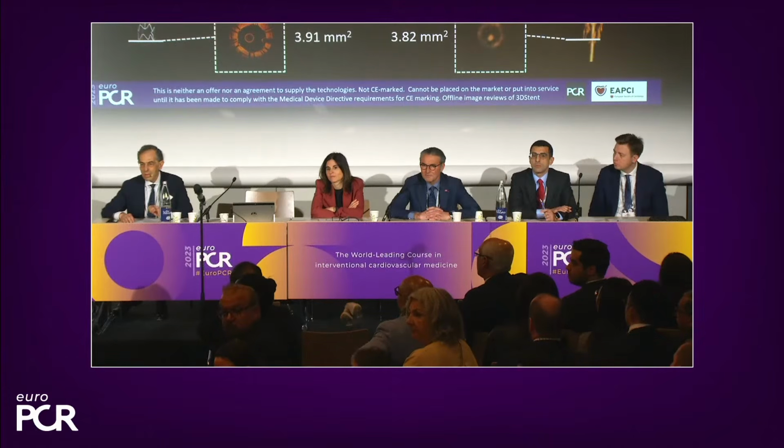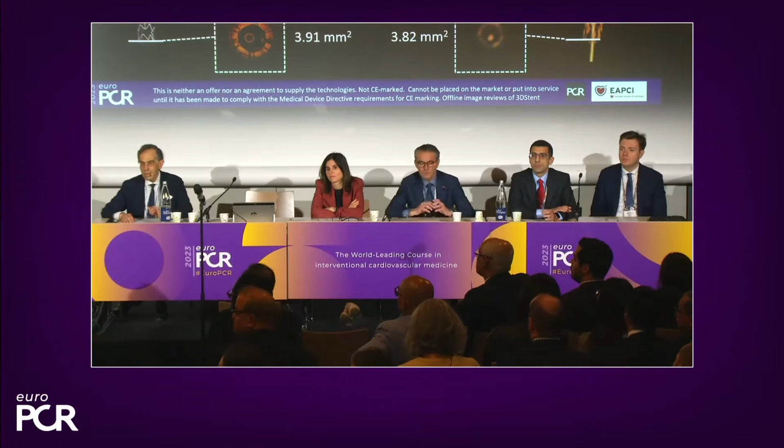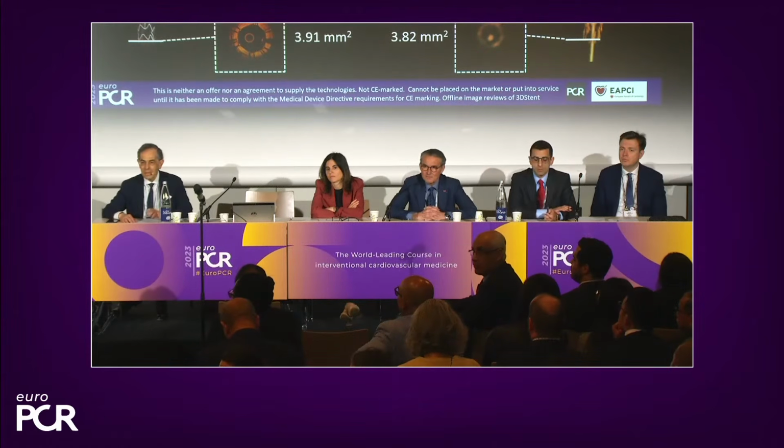In addition, with IVUS and OCT, you would have the vascular biology information, which you wouldn't have with this. And finally, since it's not validated yet, in your own center, in your experience, do you have any statistical agreement data between the two modalities?